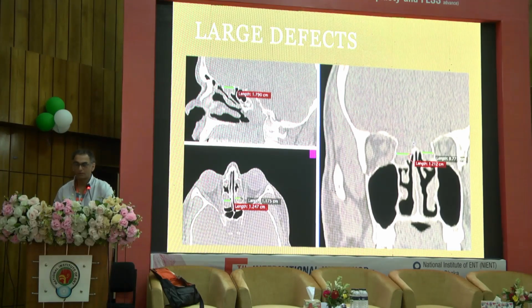Now, this is not inadvertent, and to me it is not forgivable, because this means you've taken out a big piece of bone with a heavy instrument, either a debrider or a big forceps, and you've done it not on one side, but on both sides. So this patient came to me, and what is your straightforward answer?